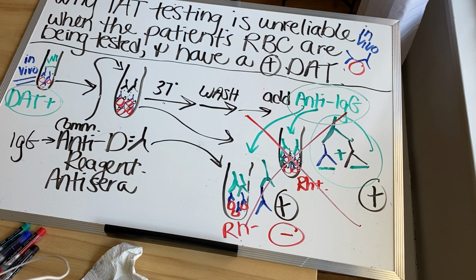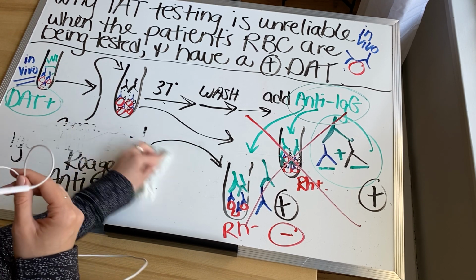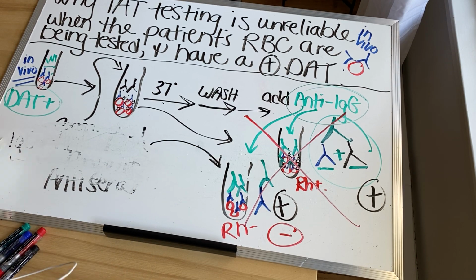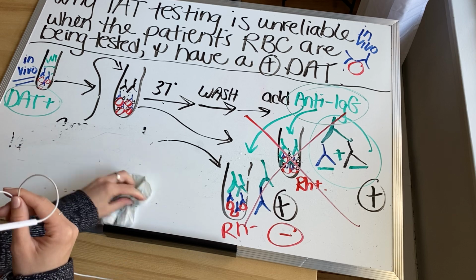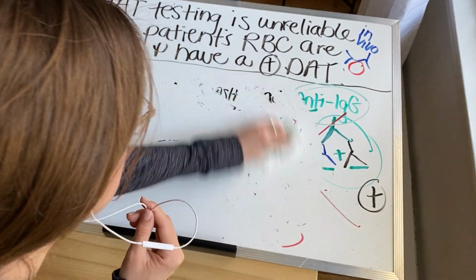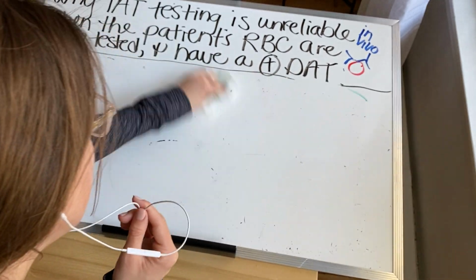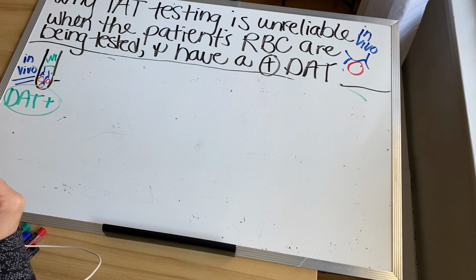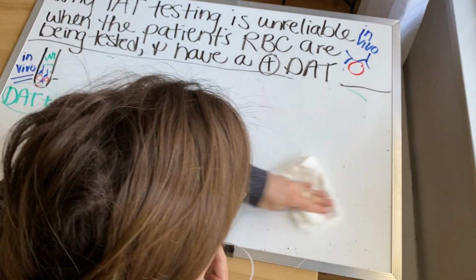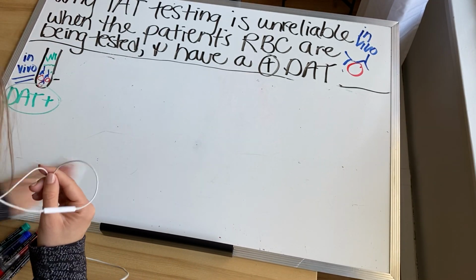So that example that I showed you, where the mom was Rh negative, we were trying to decide whether or not she should receive RhoGAM. Remember? She was Rh negative and the baby was Rh negative, but the baby had a positive DAT. We're doing antigen testing because we want to see if the D antigen is present on the red cells.